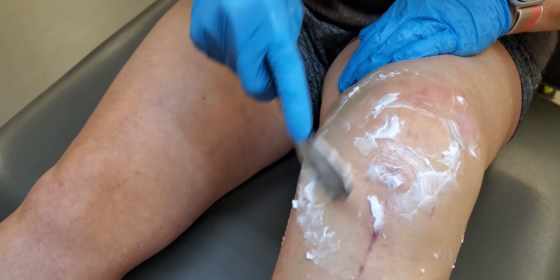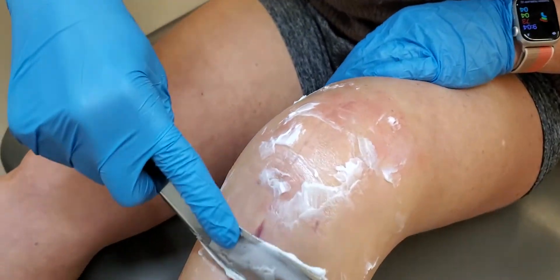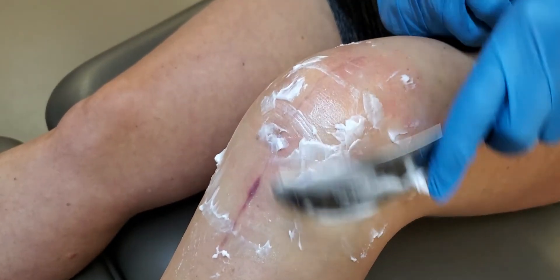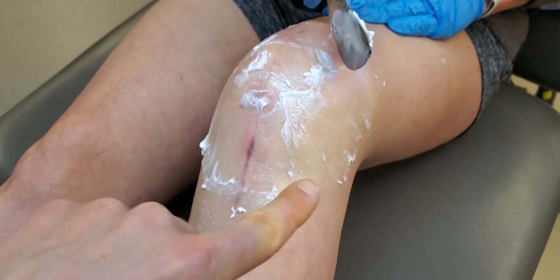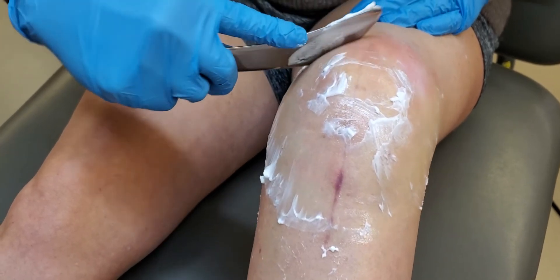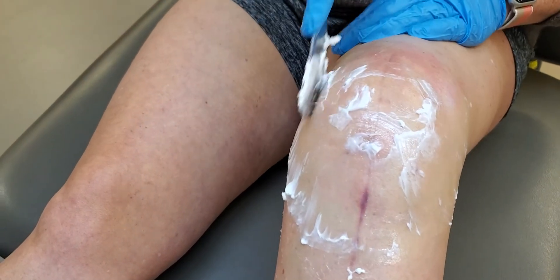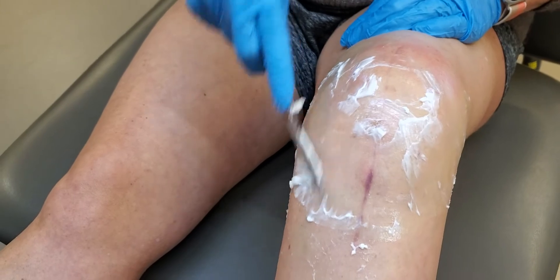You're going to go circumferentially all the way around the patella, as the retinaculum also follows that angle. This crescent-shaped tissue down here includes not only the retinaculum but also the anterior interval, the infrapatella fat pad, as well as the patella tendon — and these are key markers for limiting patella mobility.